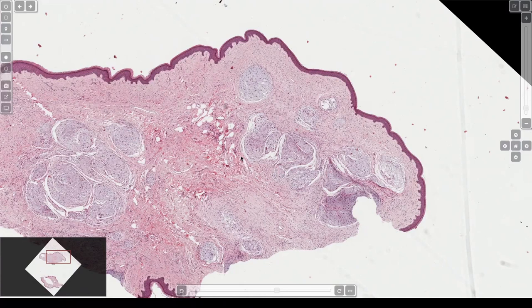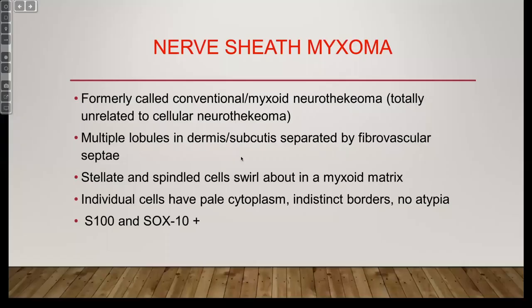It will explain in detail. If it's S100 positive, it's a nerve sheath myxoma, or what used to be called conventional neurothecioma. S100 negative is cellular neurothecioma, which despite the name is not at all neural. Don't blame me for being angry about this — it is a deep, deep hurt that we've caused to the world by naming all these things so similarly. So that's a nerve sheath myxoma.